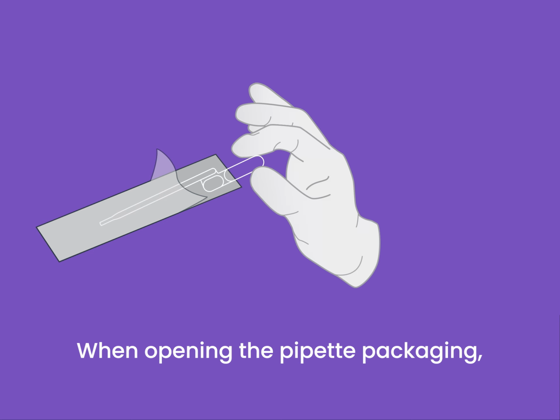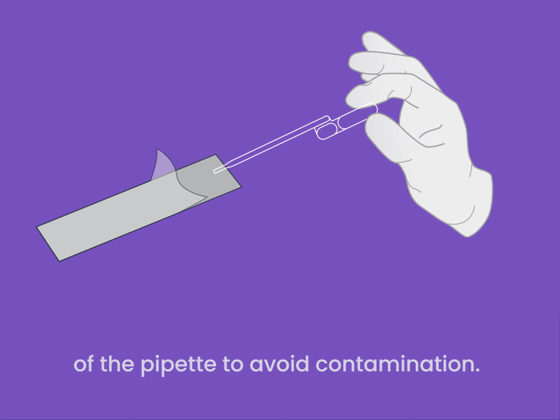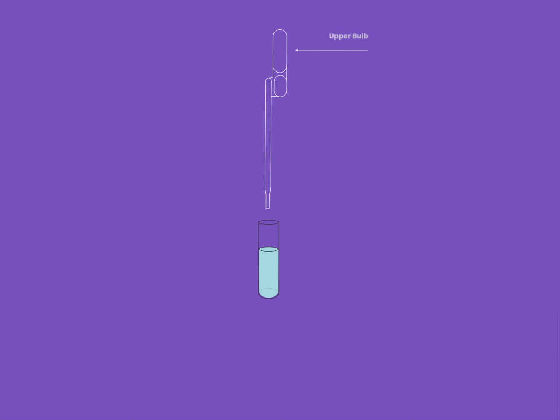When opening the pipette packaging, take care to only handle the top bulb of the pipette to avoid contamination. The four main parts of the pipette are the upper bulb, the lower bulb, the shaft, and the tip.